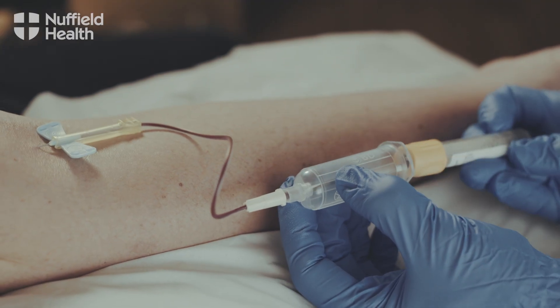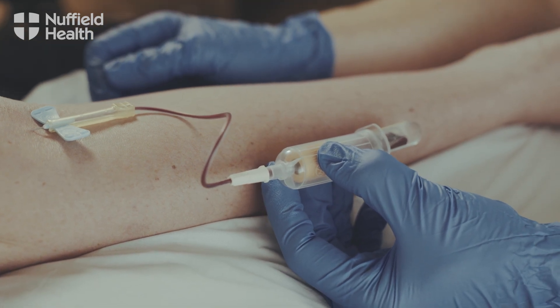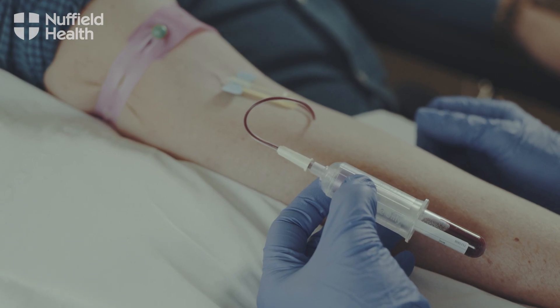The bottles then go on the end of the vacuum receiver, and each bottle has a specific vacuum for the amount of blood it needs. The bottles are colour coded for the different tests that are needed, and those bottles will be filled according to the request that the physician or the consultant has made.